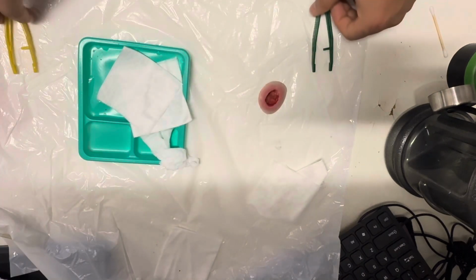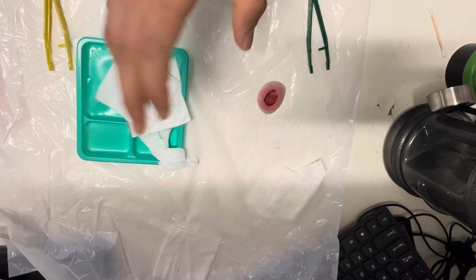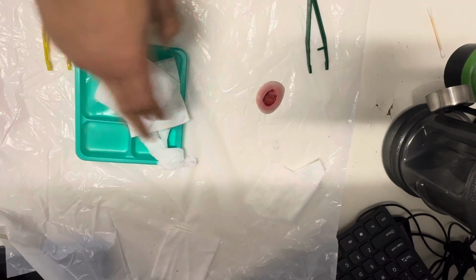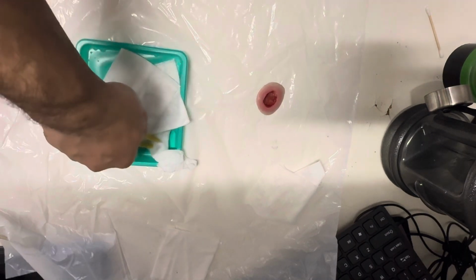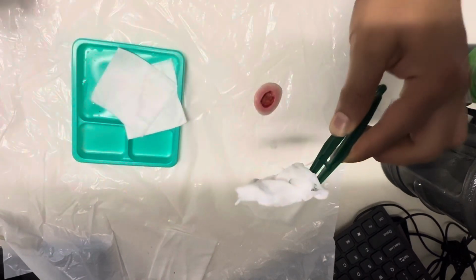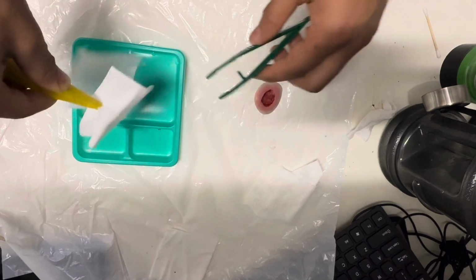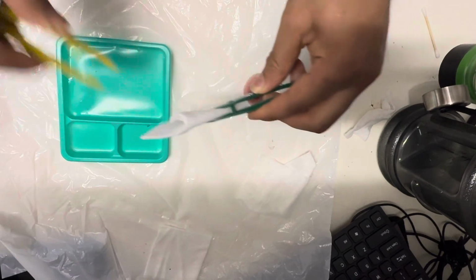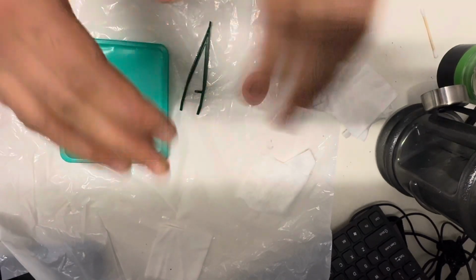Now once that is done, you also have to always be careful about maintaining the ANTT, which is aseptic non-touch technique, because you might contaminate the wound, which is absolutely dangerous, right? So how do you clean it? Take this, take out the water and use this forceps always here. One hand behind your back, clean it, put it in the bin. This one same. Clean it, then take this and tap dry. Once tap dry, you put the dressing on, and that's done. So this is how you do it.